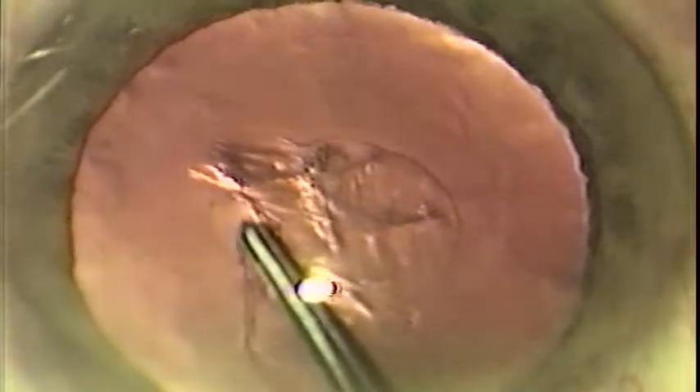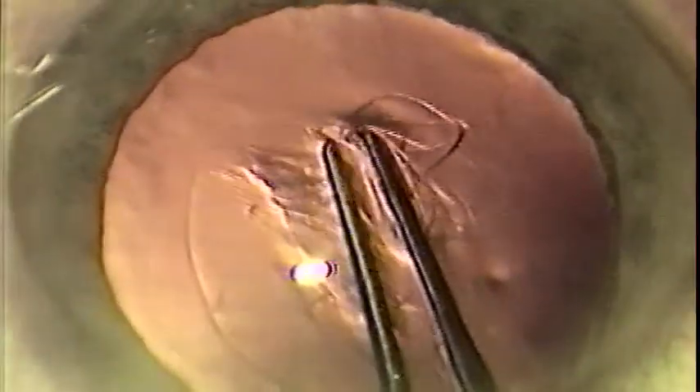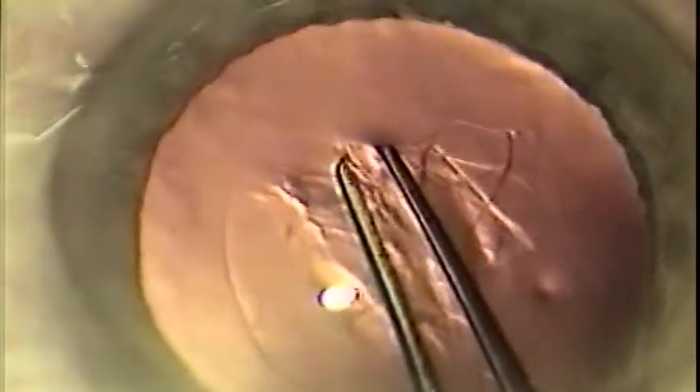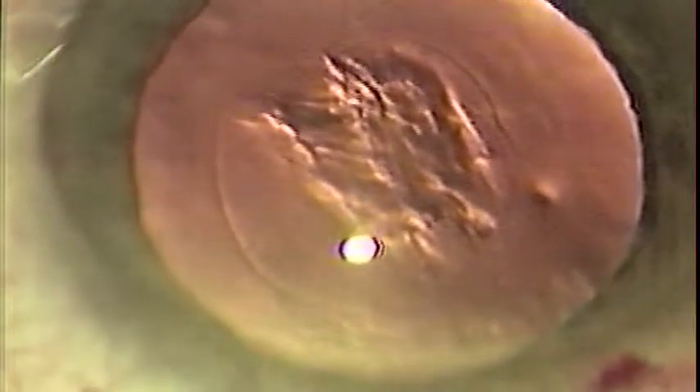If you end up with a small piece of capsular flap, as in this case, re-grasp the flap at its leading edge to gain better control of the direction of the tear. It is not important that the tear be a perfect circle every time, but that it be round and continuous with an unbroken edge. The use of a viscoelastic makes this procedure much, much simpler.